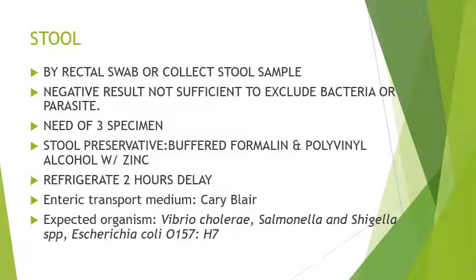Next would be collection of stool sample. Collection of stool sample can be done by rectal swab or by collecting a stool sample. It needs to be a pea-size stool sample. Hindi kailangan drum o marami. Okay? Note, a negative result is not sufficient to exclude bacteria or parasite.